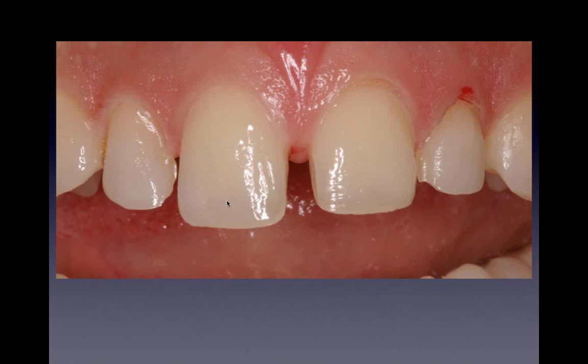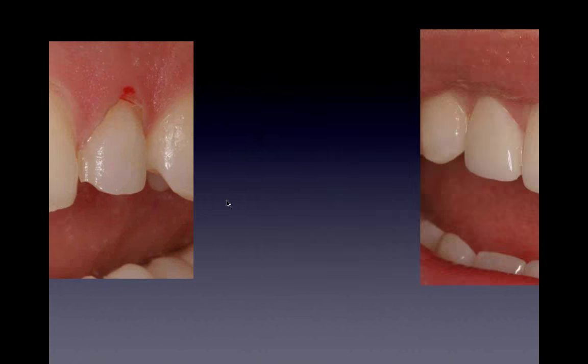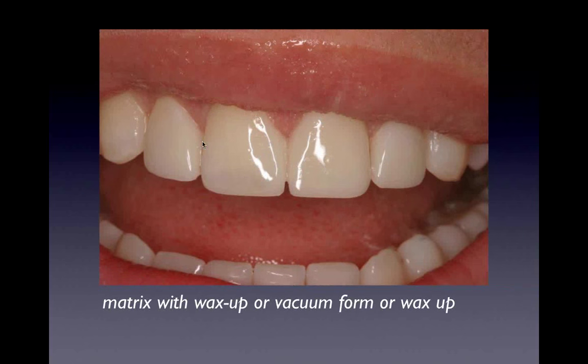Now we basically use our OmniVac with our composite and our dentin bonding techniques, and we put the whole thing in position, one tooth at a time, and we start contouring, and we get a result like this. So then I'll do my little contouring from the back, the matrix with the wax-up form, and I'll do all my recontouring, all my polishing.